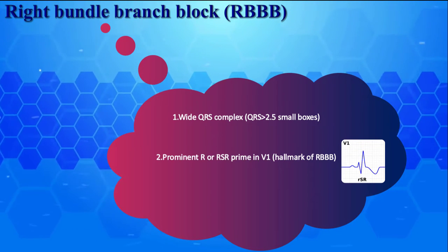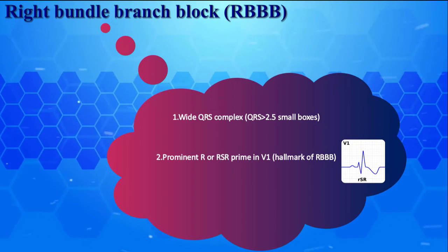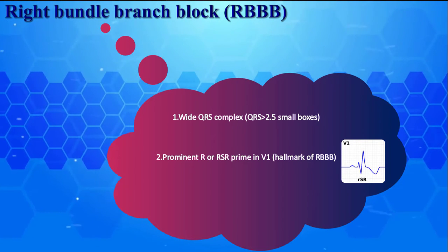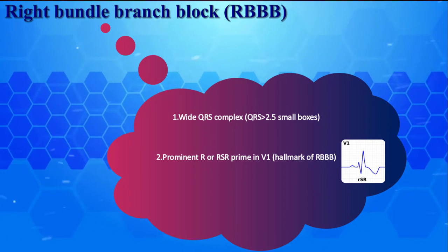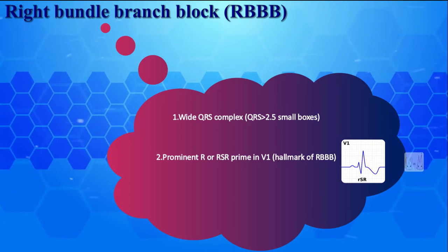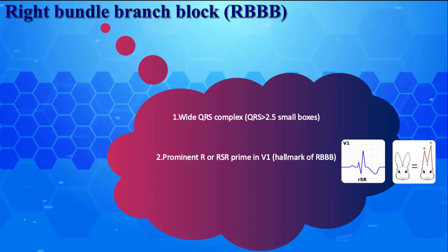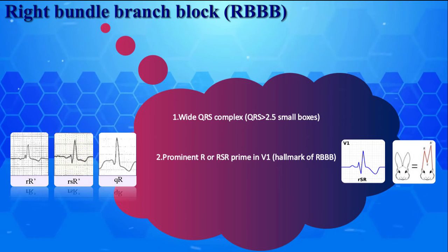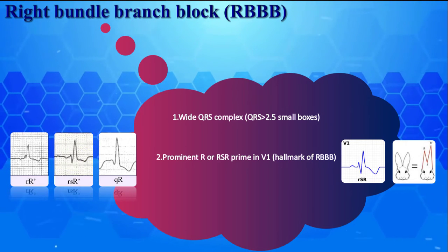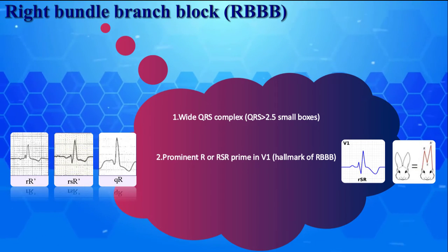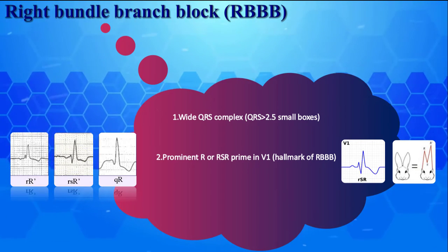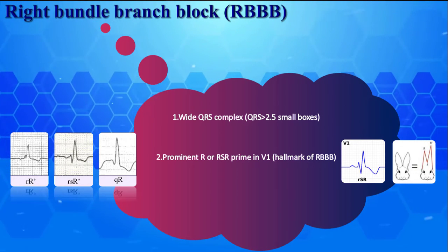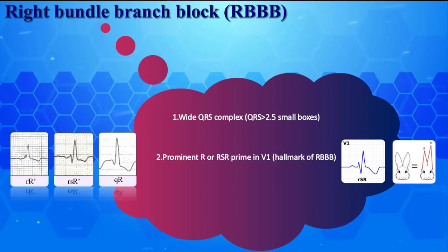Second, prominent R or RSR' in V1, which is the hallmark of RBBB on surface electrocardiogram. It is also known as the rabbit ear pattern. Here are various RBBB morphologies in lead V1. As you can see, RR', RSR', and QR are three possible patterns of RBBB in lead V1.